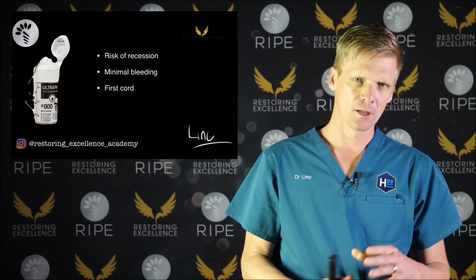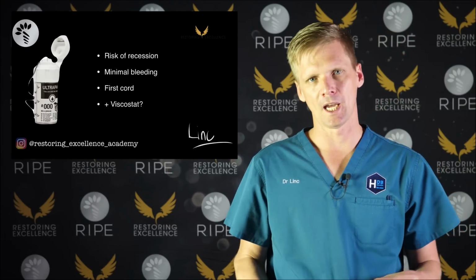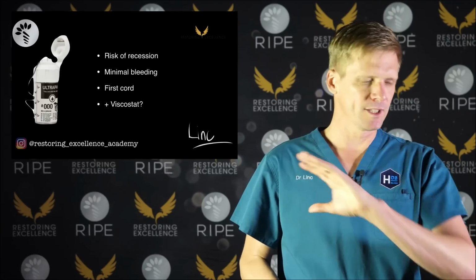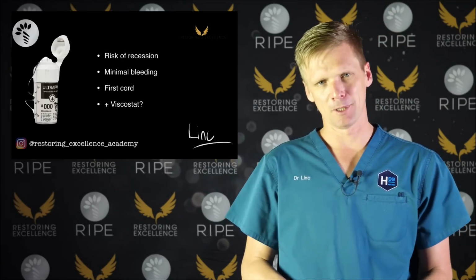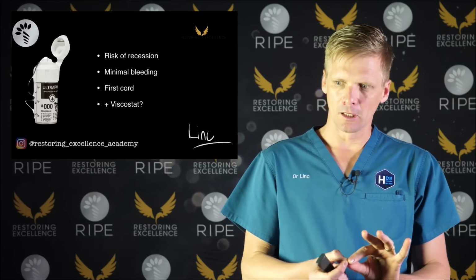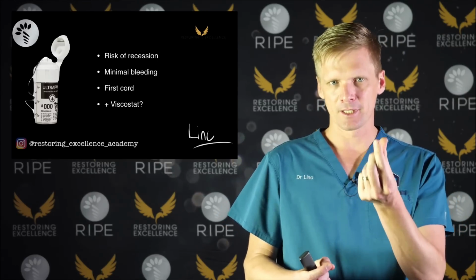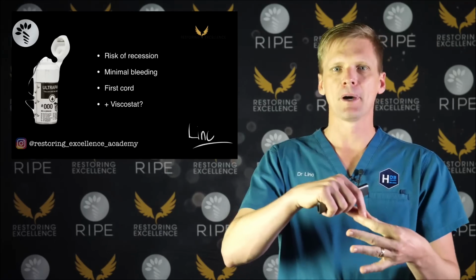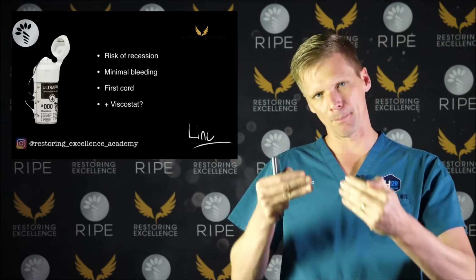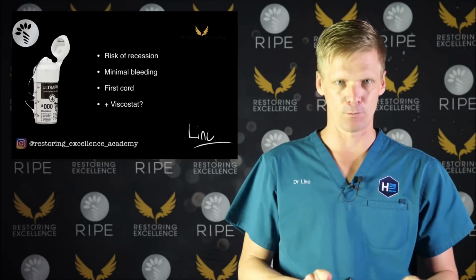Now the question is, do I use it with Viscostat or without? Most of the time I'm going to use it with Viscostat, because most of the time I'm using cord because the patient is at risk of bleeding. So I put Viscostat in a little Dappen dish and pull the cord through, but most importantly you then have to dry it off, because if the cord is wet when you're trying to pack it, it doesn't go into the sulcus as well.